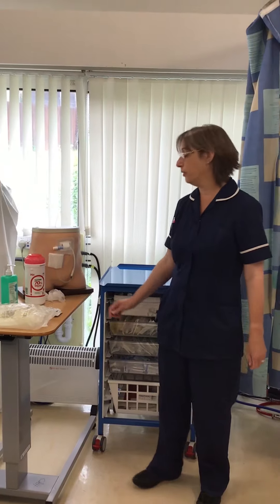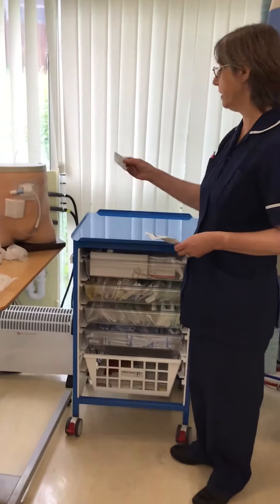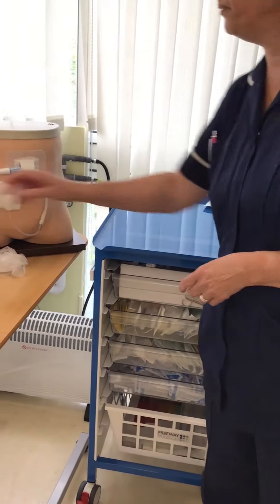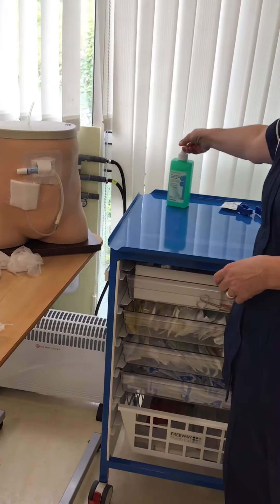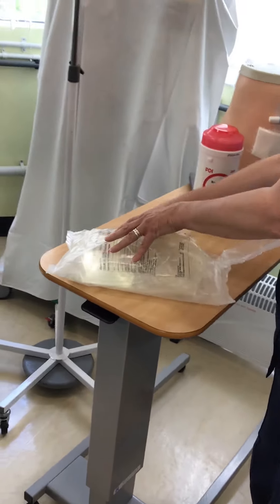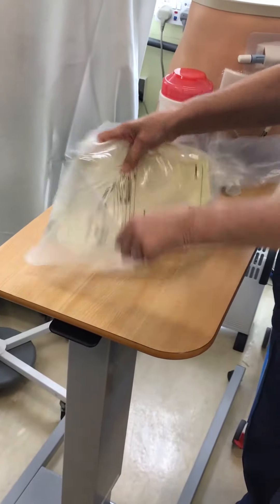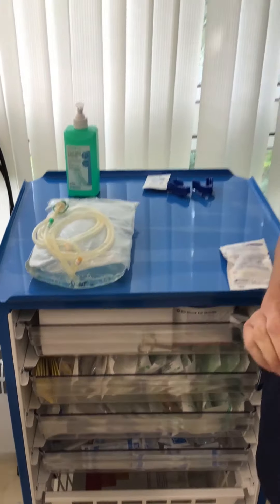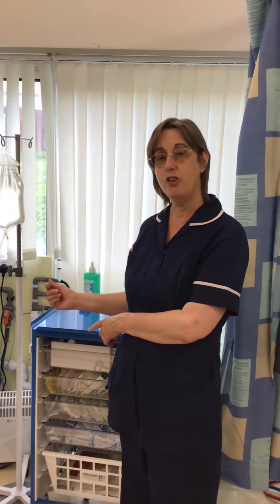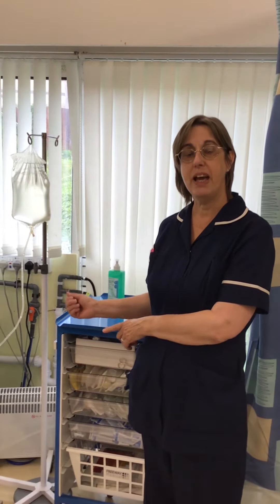Next, put your supplies onto your clean surface: your cap, your shield, two blue clamps, alcohol hand gel, and remove the dialysis bag from the outer pouch, placing the clean pouch onto your surface with the lines uppermost. Although for demonstration purposes I am talking over my exposed PD line, it is recommended that during this procedure you do not talk.